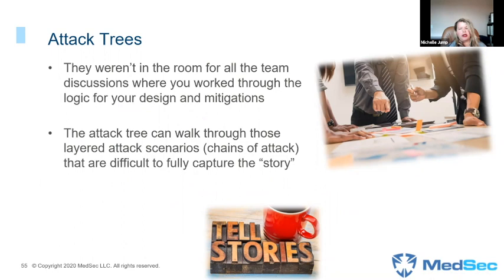So I kind of already mentioned this, but the big value that I find in attack trees is that your teams have gotten to the point where they are with a particular risk or threat because they've talked about it, right? But the FDA wasn't in the room when you were having all these discussions. It's the same thing. I do a lot of standards, and I know why we wrote certain clauses in a standard because I was in the room. But if you weren't in the room when they were creating that standard and having that discussion about all those specific words that were used in that clause, you won't have the context. So attack trees are great for providing context and detail about what a particularly complex or high risk attack scenario might look like. Again, tell the story, explain it, and give folks the full context when they're looking for something.